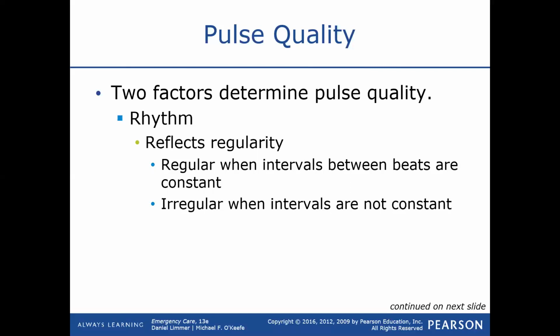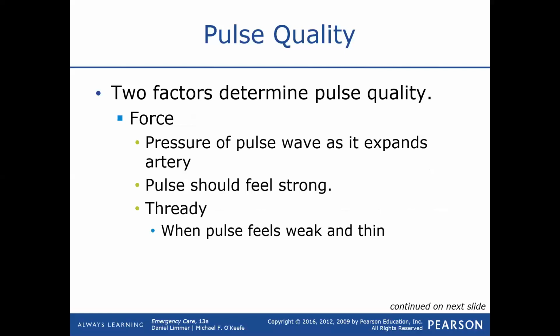Now, if somebody has AFib, for example, atrial fibrillation, and they have a different heart rhythm where it's not a constant boom, boom, boom, boom, they might be bouncing around a little bit. That pulse oximeter is not going to read that correctly, because it's based on every beat that it picks up between 2 beats, and it constantly changes the number based on that. So if somebody has a skipping heartbeat for some reason, then that machine's going to read that incorrectly. So be aware of that as well. But we always have to take a quality with the rate.